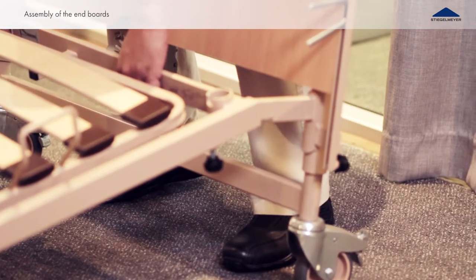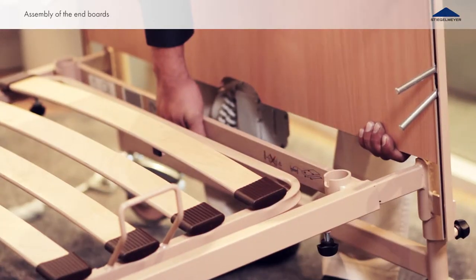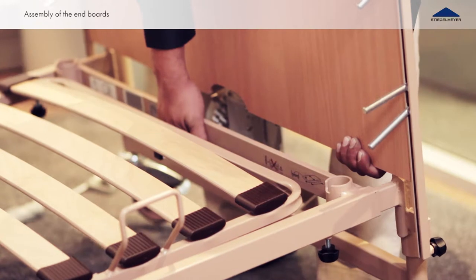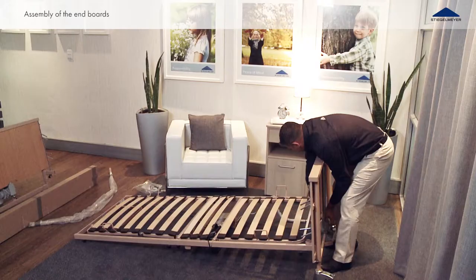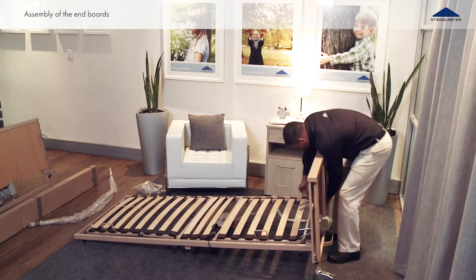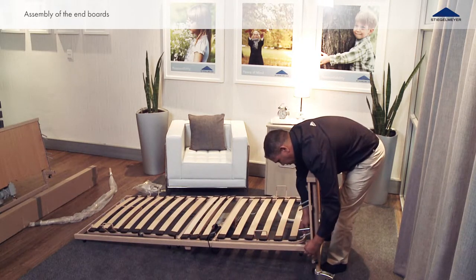Lift the reclining surface frame at the head side and push the two support brackets from the head section end board into the tubes of the reclining surface frame to the limit. There should only be a five millimeter gap between the reclining surface frame and the corner post.